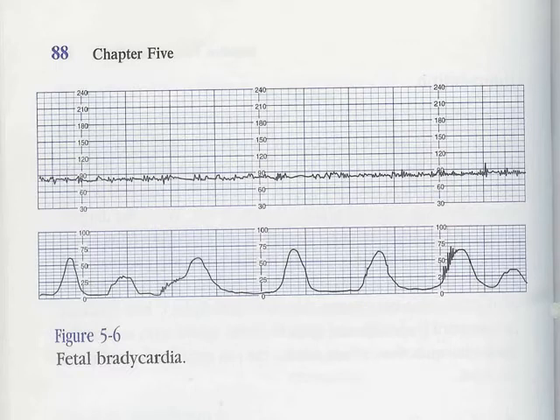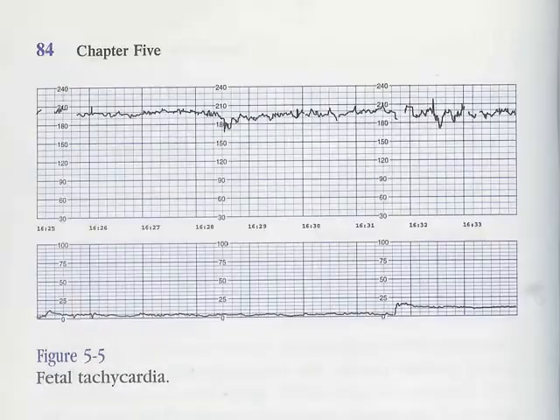All right, here's fetal bradycardia. What is the baseline? I'm going to let you tell me first. You're not going to tell me, I'm on a video, but you can tell yourself what you think the baseline is. Pretty straightforward. You should have said 80, okay? What is this baseline? Saying about 200, you'd be right. Fetal tachycardia.